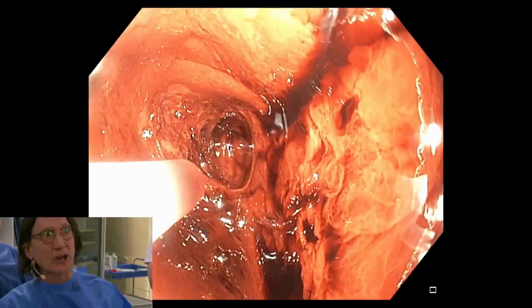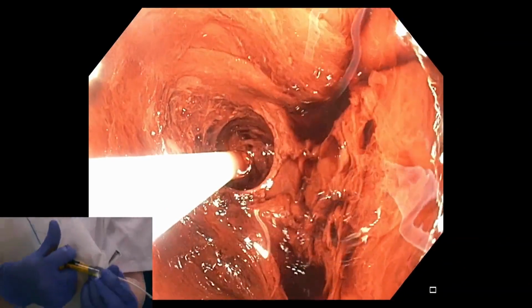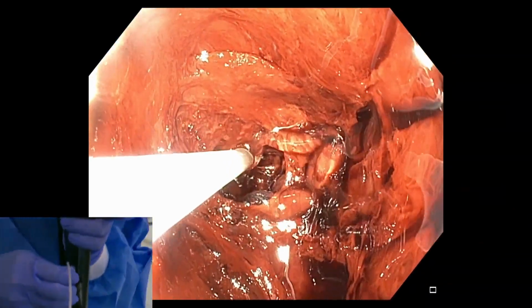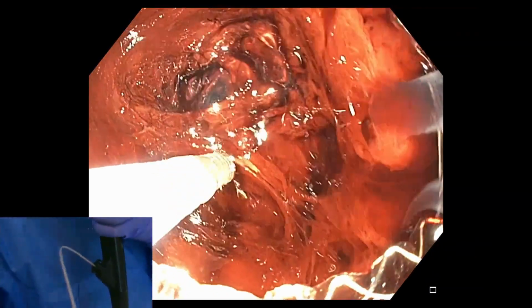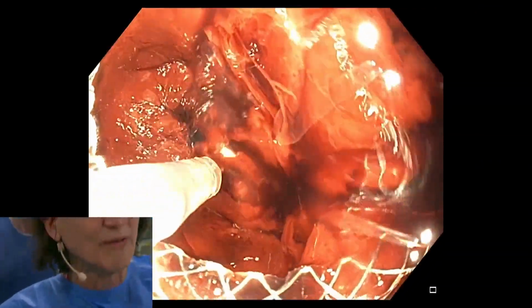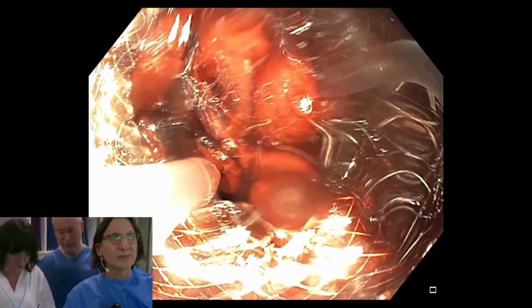So now Hannah's going to start injecting. You're going to see the gel just sort of drip out here. So she's pushing this out. And I just want to have enough gas so you can see how it's a thick gel. And I'm just pushing down a little bit. And I'm just going to fill up this cavity like this, move it around a little bit. And I've had a few cases now that I've been able to treat very successfully with Purostat, with bleeding after doing necrosectomy, for example. And it's actually quite a lot of gel that comes out of this.